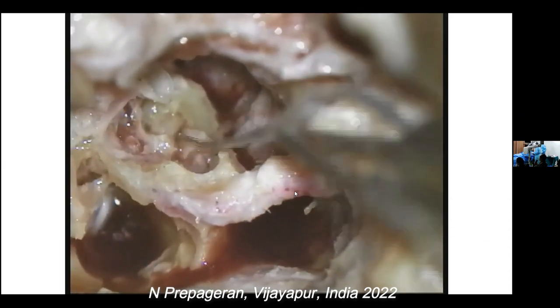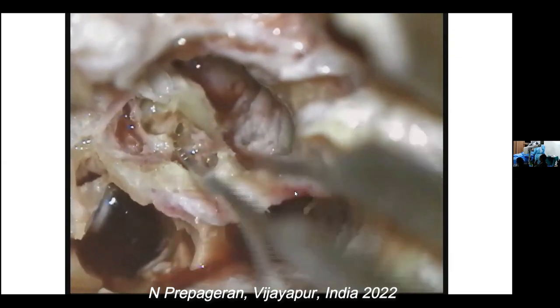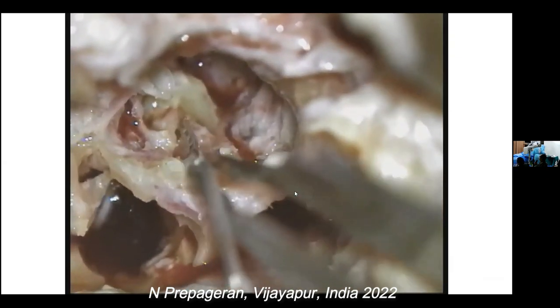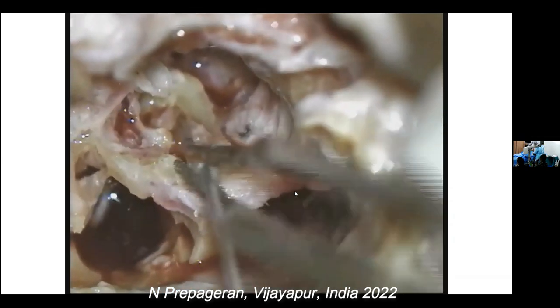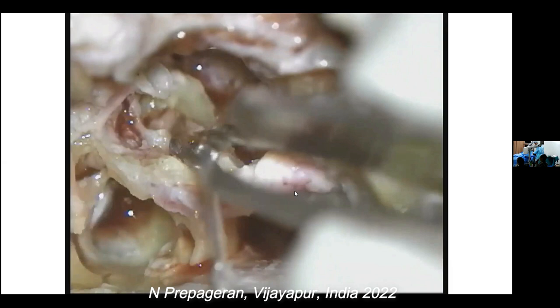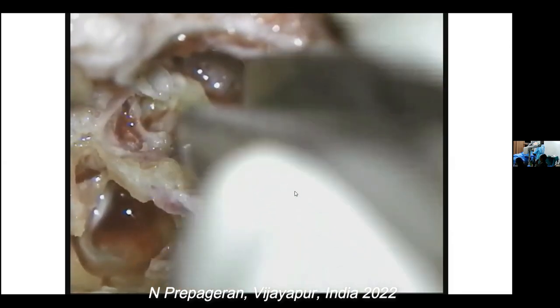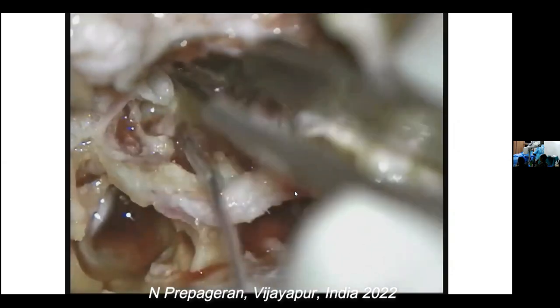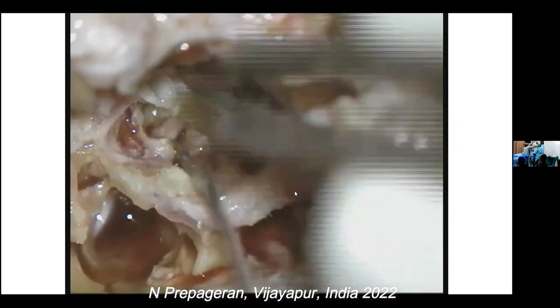Why is it suddenly bleeding? Why is the jugular bulb suddenly bleeding? So that's how you insert through the round window into the scala tympani. Can you guys see that? Yes. Okay. So let's leave it there and let's drill around it. What do you think? Yeah.